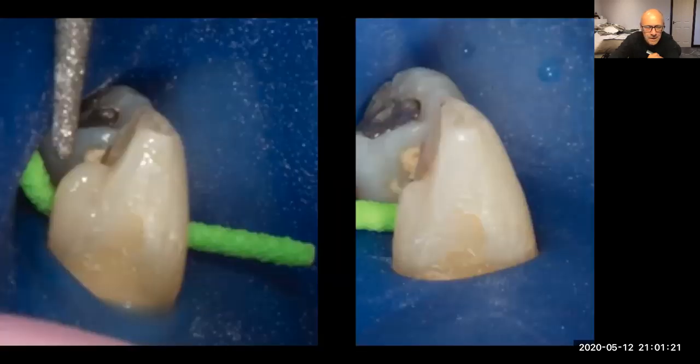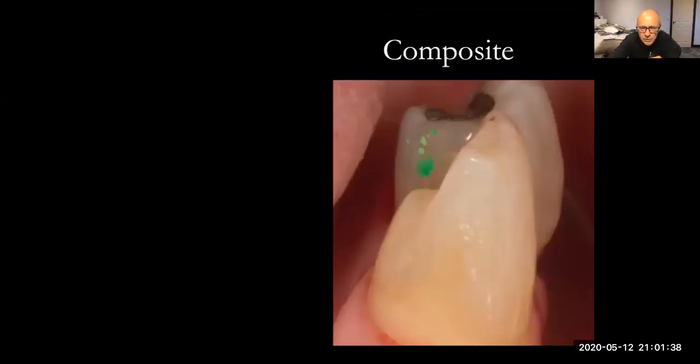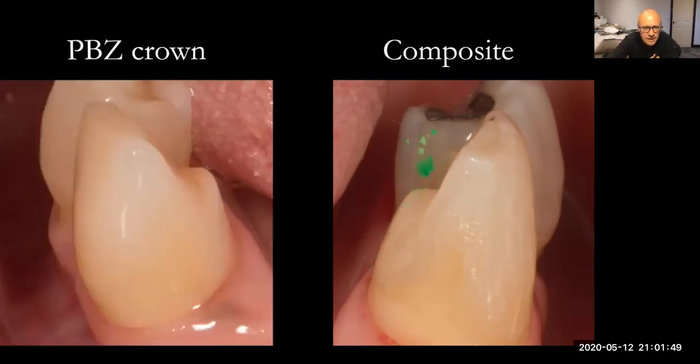It's lovely. I use a crown preparation chamfer diamond. This is a Shofu chamfer diamond. And just trim off this to make it look like that. Just neaten it up. And then use an enhanced finishing burr. It's beautiful. So that's it finished here. You can see that just there. Lovely composite.